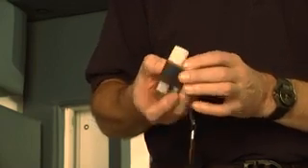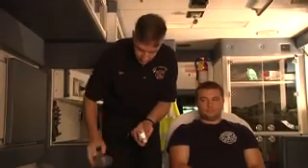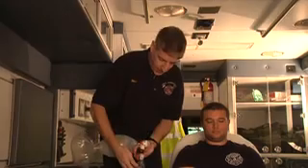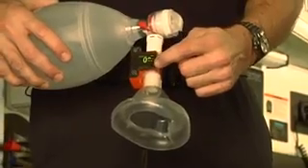It has an adapter that snaps into the device, turns on with a very small power switch, then connects directly to the bag valve mask and allows you to see a respiratory rate and an exhaled carbon dioxide level from the patient.